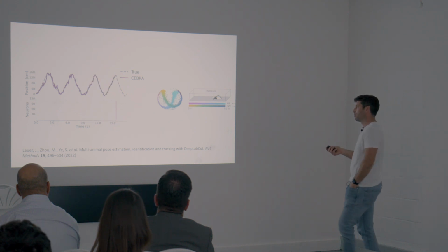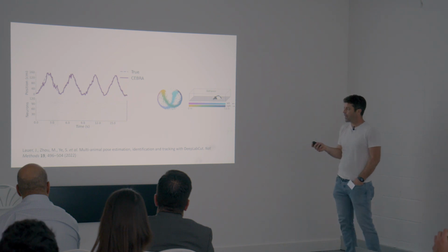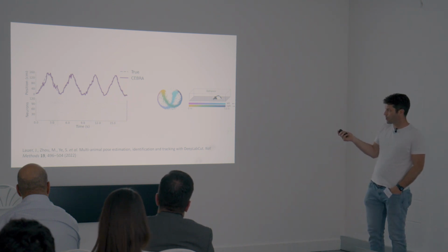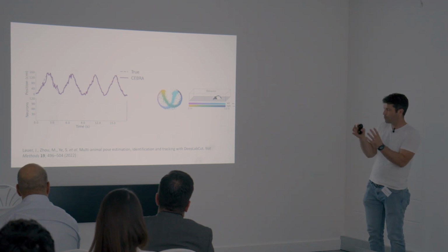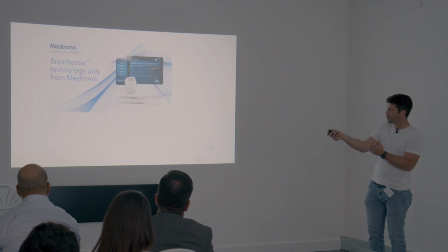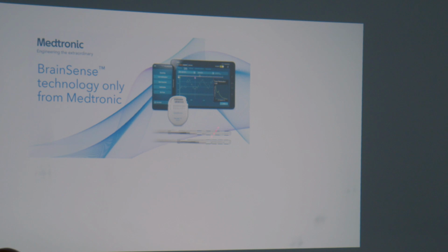And what's cool about what's happened recently in the DBS field is that the stimulators that I've shown you previously, most of those leads that relate to pulse generators, are typically only stimulating, they're not recording. But recently, Medtronic brought out a system called the Percept system. It has BrainSense technology. That is a deep brain stimulation system that can stimulate populations of neurons within the brain but also record the local field potential at the same time.